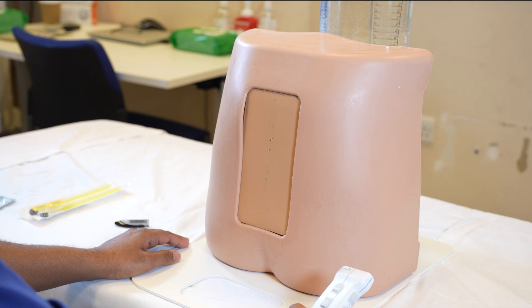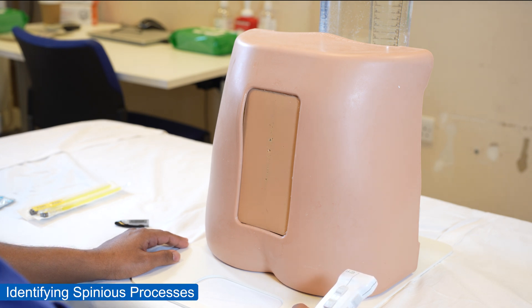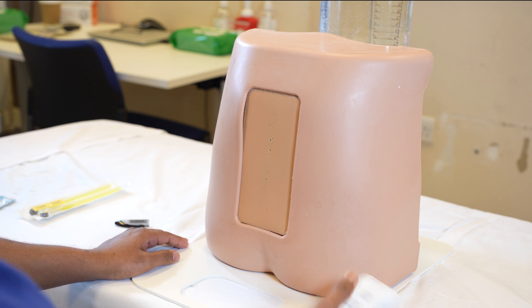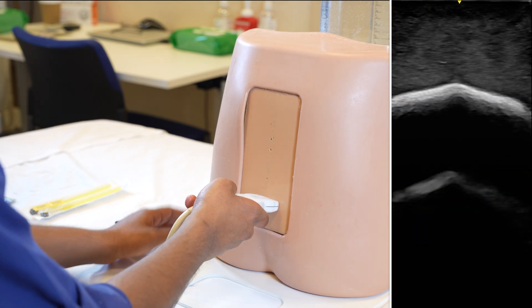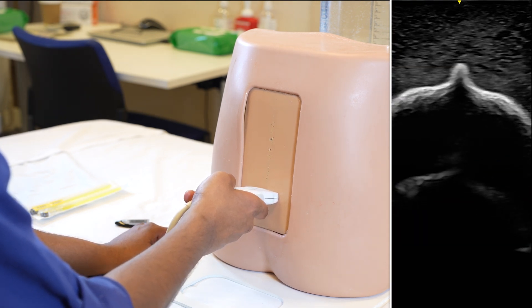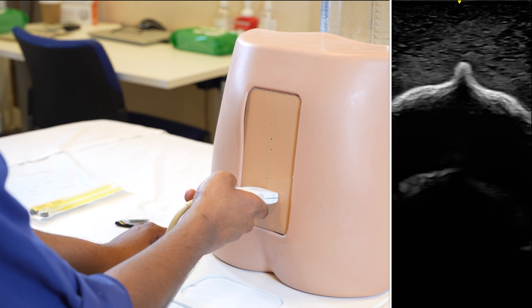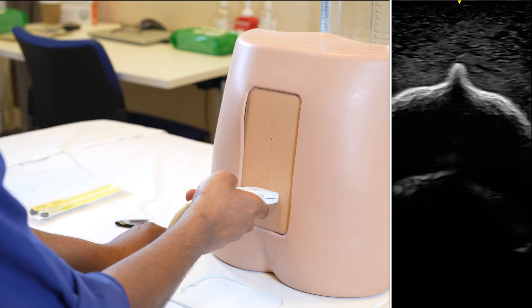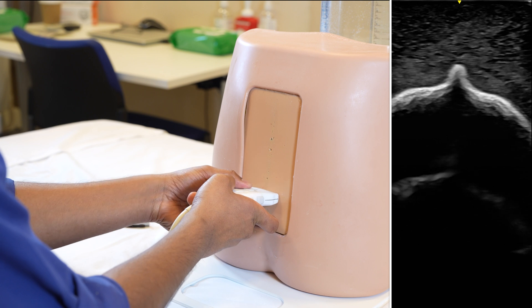The first thing that you want to do is understand what your level of your spinous processes are, and one of the best ways to do that with ultrasound is to start at the level of the sacrum. Start the probe quite low at where the sacrum would be and wait till we get a hyperechoic hump with a broad base, and make sure the hump is at the midline. Once we get a crisp picture and we have the hump in the middle with the broad base, that's the sacrum and level of sacrum.